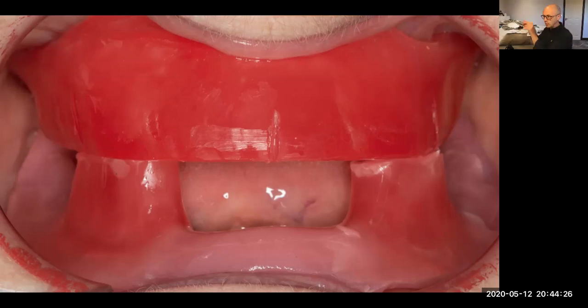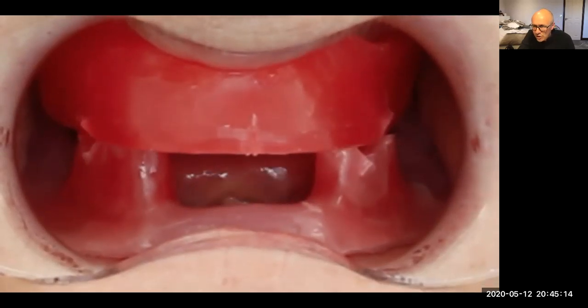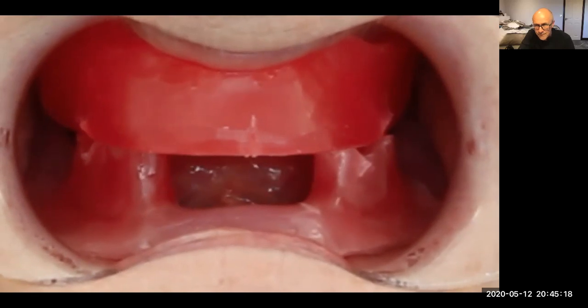And often what I feel is the patient's lower jaw will go clunk back. I can just feel it go back into CR and then close together. And then I double check that it's all marrying up. What I've done is, you can't see it very clearly here, but I put a line on there all the way down on both sides, and I double check that those lines marry up. And when I'm happy that they're marrying up, I will also take them out and cut a groove in both upper and lower and fit them back in the mouth. And then I want to see this happening. This is the patient opening and closing here in a reproducible position, which I'm hoping is CR.